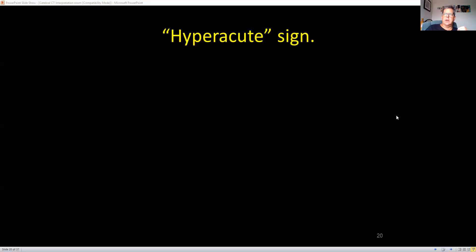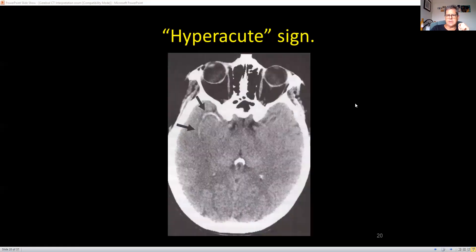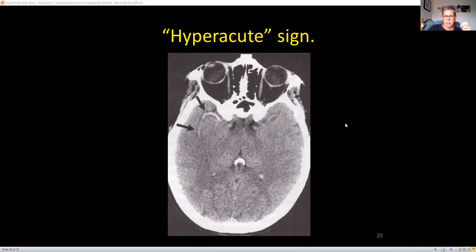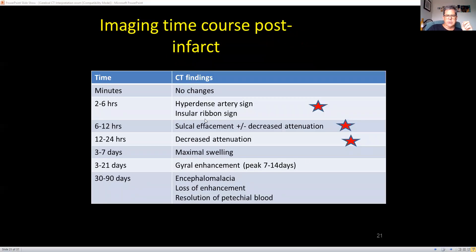When you first get a thrombotic or embolic stroke, you may see very early signs. You may see a hyperdense vessel — an artery — sometimes just appearing as a blob. This should make you think about rapid reversal, either with thrombolysis in the appropriate patient or with clot retrieval. Very early on you can also see what's called an insular ribbon sign — the insular area becomes edematous and one side compared to the other looks a bit blurry.